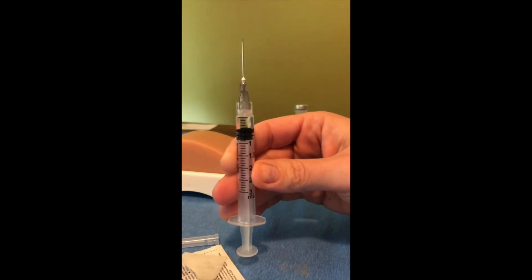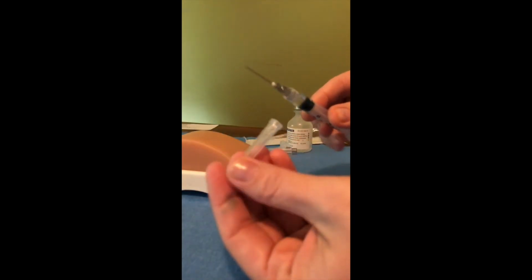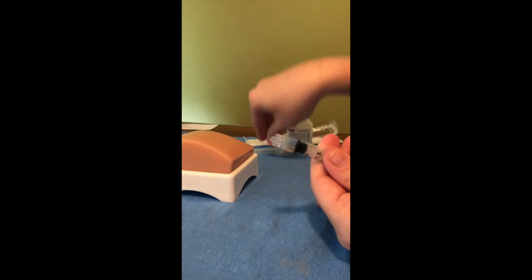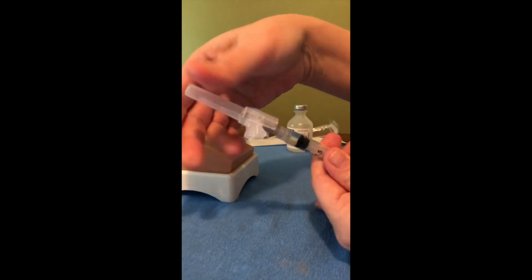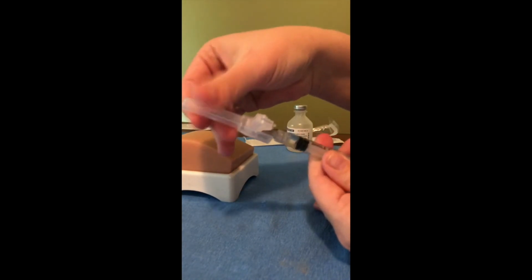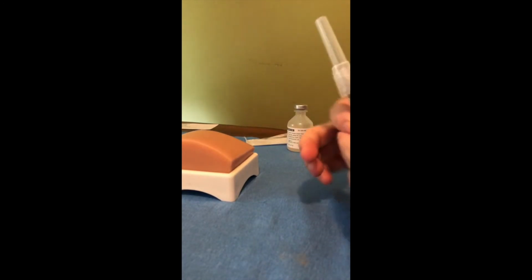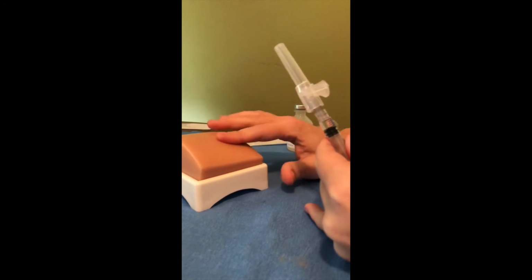So I've got 0.5. Now I'm going to switch my needles. I'm going to unscrew this. Now I'm going to put on my injection needle. This is the 22 by 1 inch intramuscular. So this is going to go into the muscle. So we're going to pretend this is our deltoid.